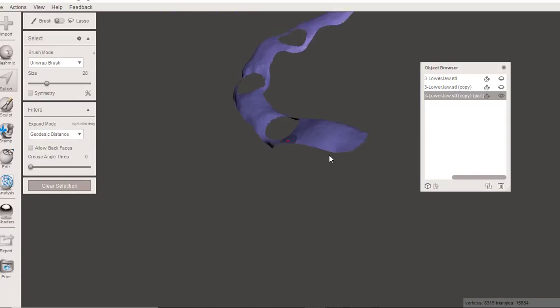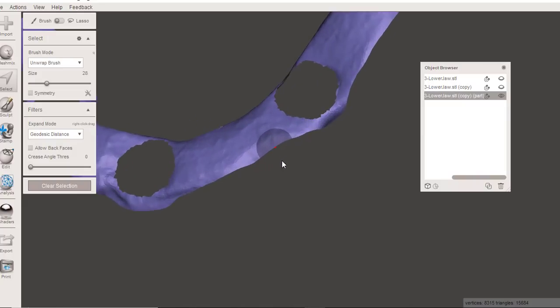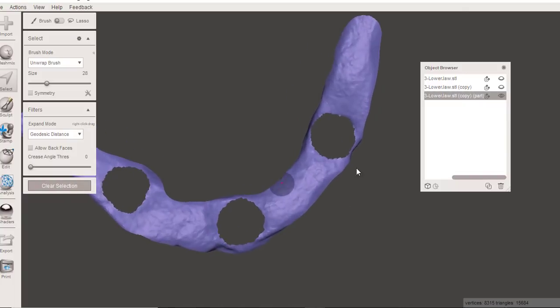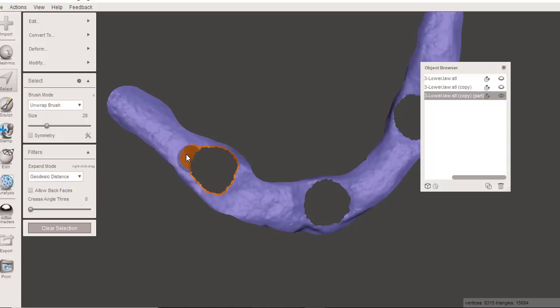So now I've gotten rid of all the little vestiges of the UCLA abutments. And at this point, we can now do an extrusion of this. Now, actually, there's probably one step we should do, and that is to smooth these holes to make this as smooth of a transition as possible.